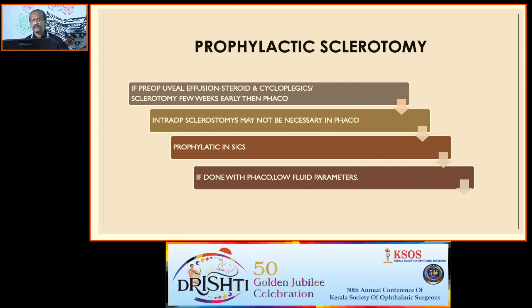And prophylactic sclerotomy with cataract surgery, previously every other case we used to do, but nowadays with Phaco, it is advised, it's not essential because today's Phaco surgery is done in a very closed, tight compartment with the intraocular pressure being retained throughout the surgery. However, when you are doing SICS where you are opening up the eye and the eye goes into hypotony for some time, it is always better to combine with sclerotomy. There is a study from Aravind.